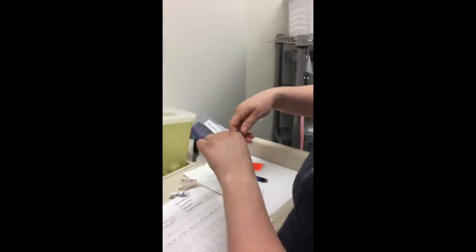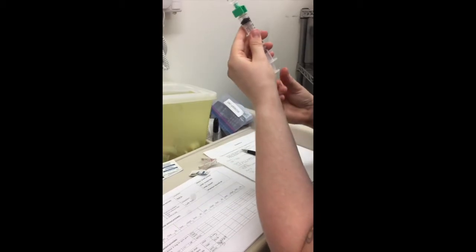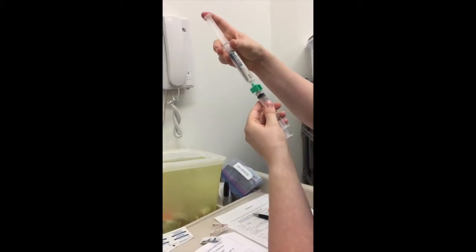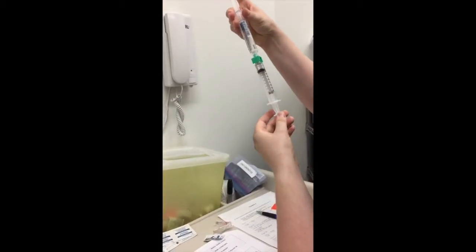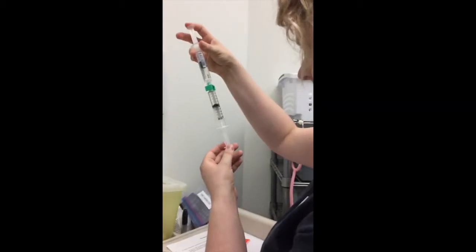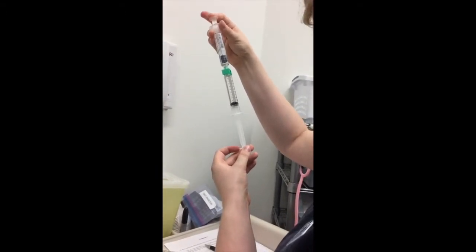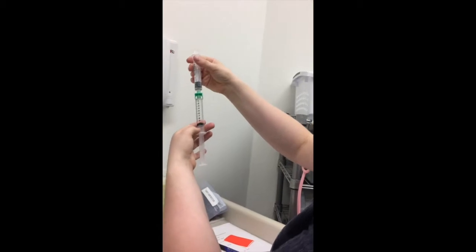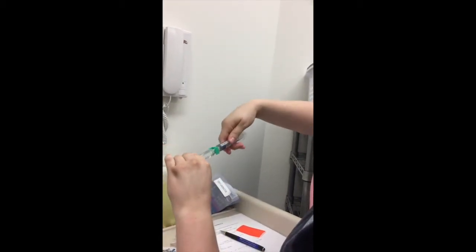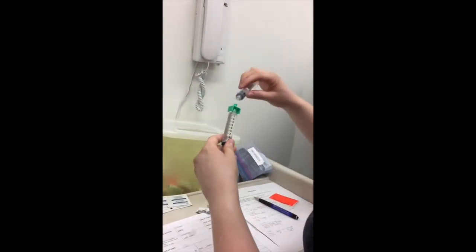So I wanted to add 9 mils of normal saline. So now I'm going to be instilling 9 mils of normal saline to get a total syringe volume of 10 mils. And I've got my 10 mil syringe volume here. So now I'm going to be wasting that last mil.